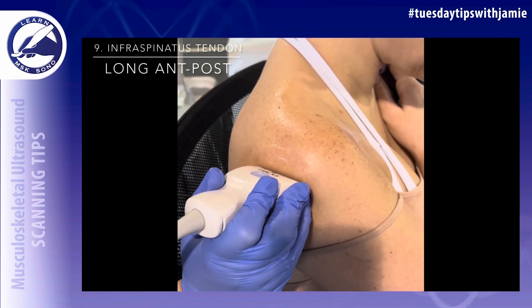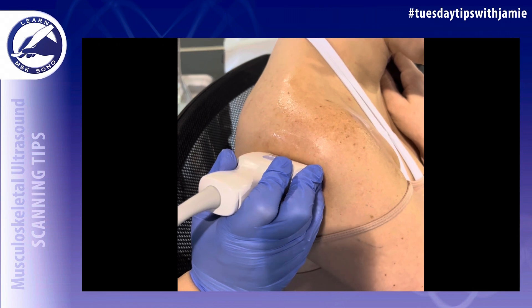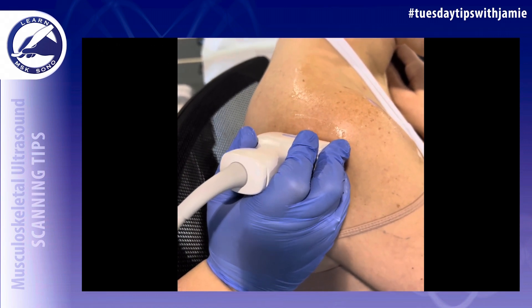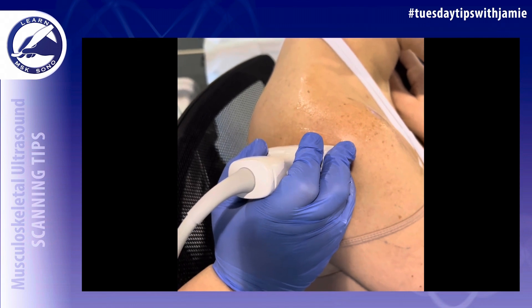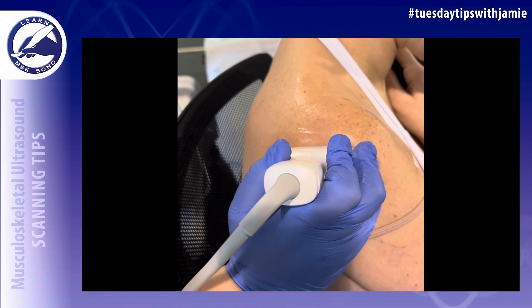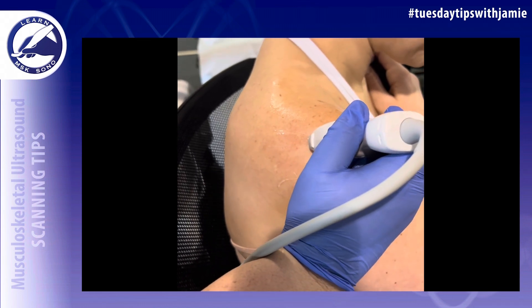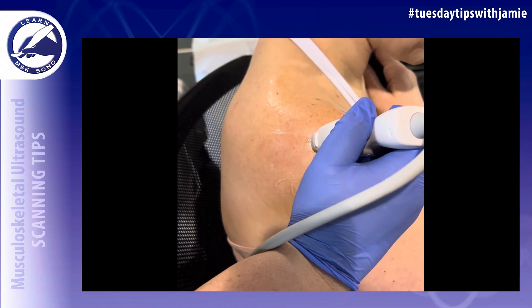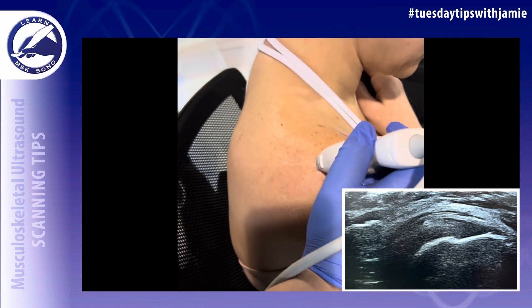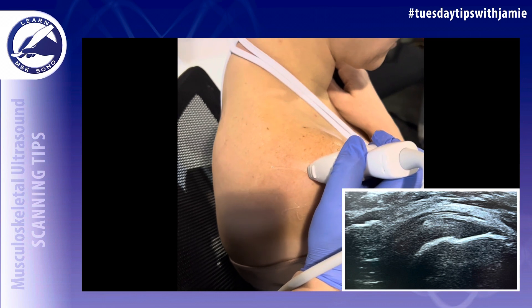Use the glenohumeral joint as your landmark for the infraspinatus tendon. Slide slightly up and elongate the infraspinatus tendon in the long axis, then slide the probe at this exact angle anteriorly until you're at the footprint of the infraspinatus tendon. Scan it in the long axis from anterior to posterior.